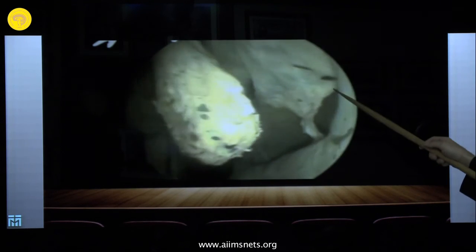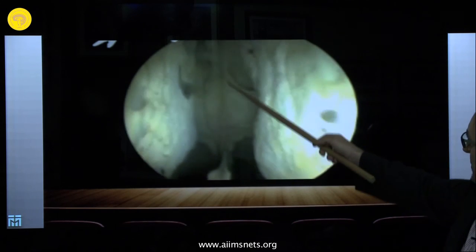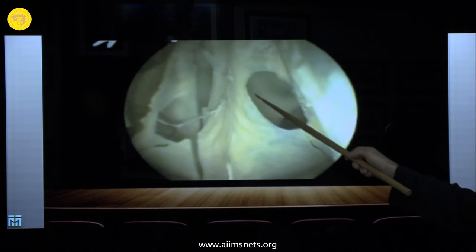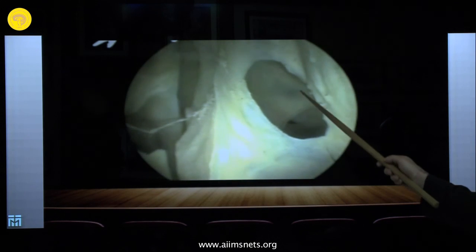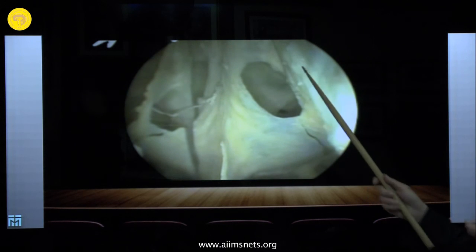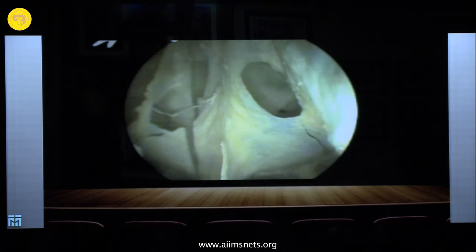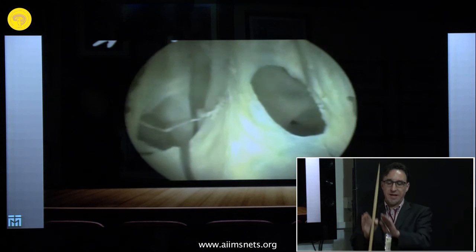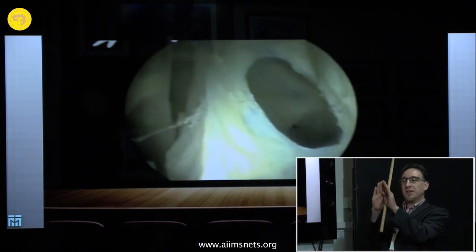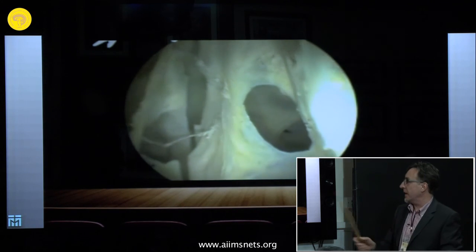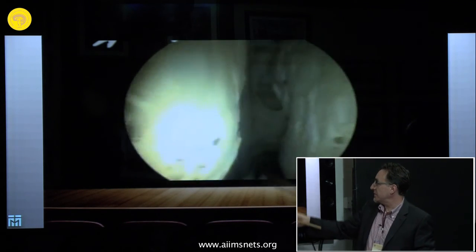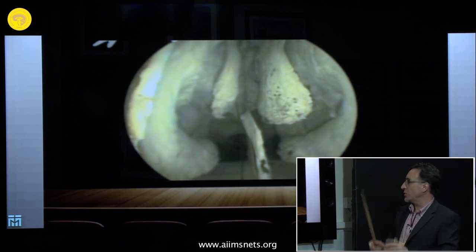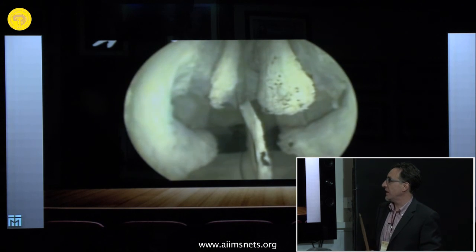The rostrum is always a midline structure — it looks like the keel of a ship and is always in the midline. The sphenoid ostia can vary in shape and size but are always present, though sometimes covered by mucosa. The nasal septum may have deviations, and the intrasphenoid septum may deviate, but the rostrum is always midline and serves as a reliable orientation landmark.